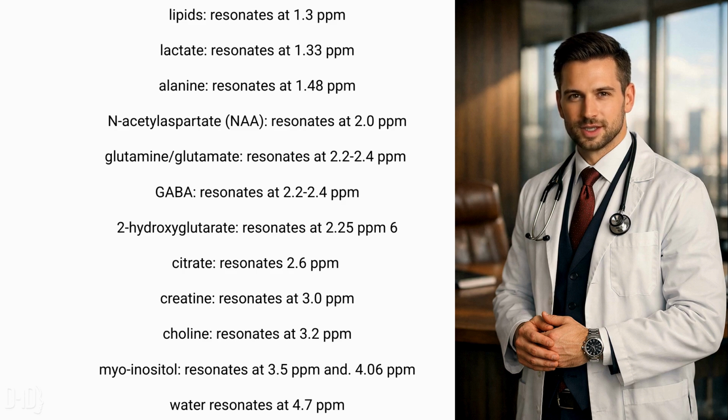2-hydroxyglutarate resonates at 2.25 ppm. Citrate resonates at 2.6 ppm. Creatine resonates at 3.0 ppm. Choline resonates at 3.2 ppm. Myoinositol resonates at 3.5 ppm and 4.06 ppm. Water resonates at 4.7 ppm.